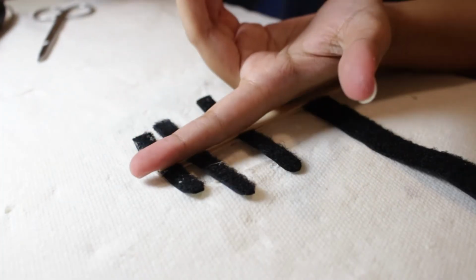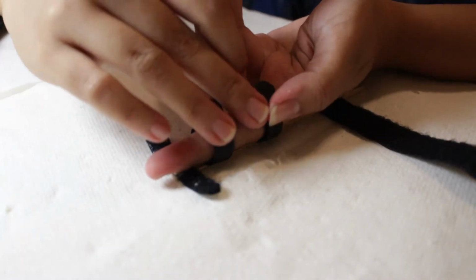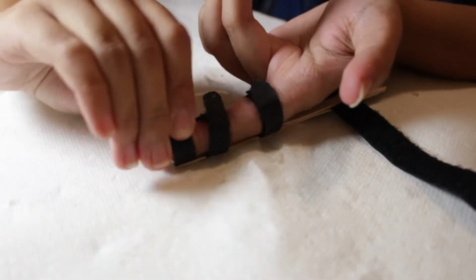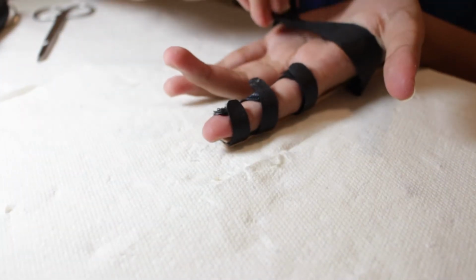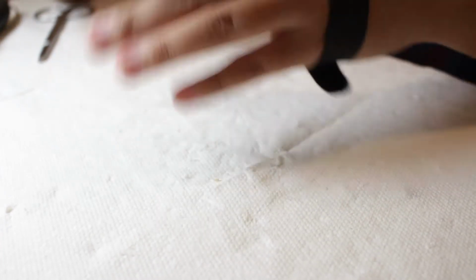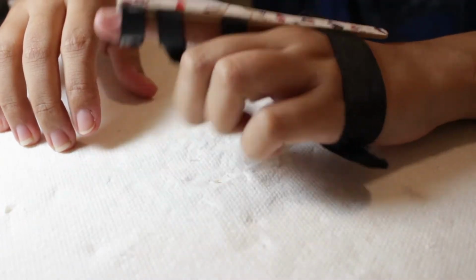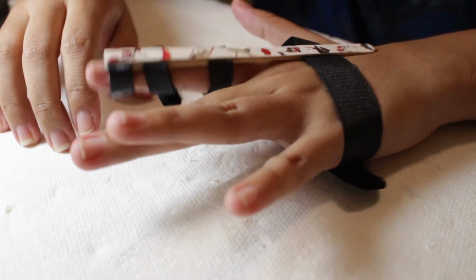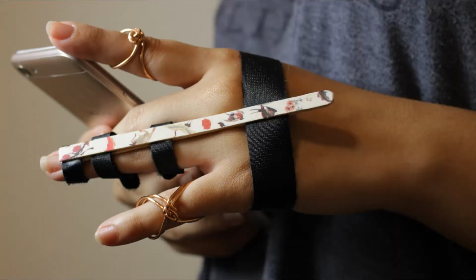So here I am showing you how to apply the splint by yourself. This can be worn on any finger except the thumb. Make sure that the straps aren't too loose that it would fall off, or too tight that it could occlude the blood flow to the finger. Then make sure that the popsicle stick doesn't go beyond the nail bed so that it's easy to check for capillary refill. So there you go, that's the first splint that we've done today.